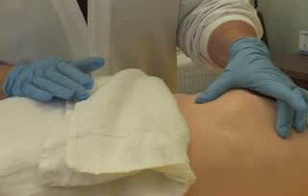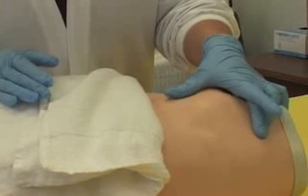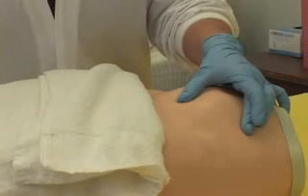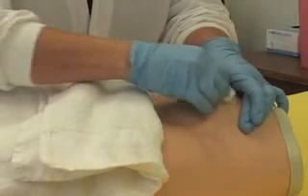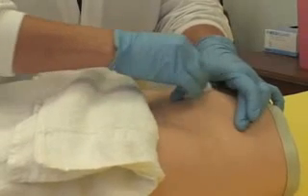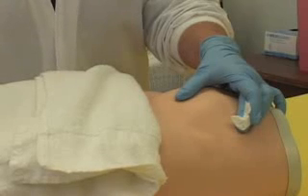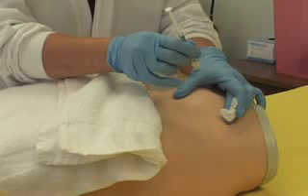Grasp and bunch enough tissue to allow an area of approximately 2 inches in diameter to be cleansed and to prevent accidental needle sticks to non-dominant hand. Cleanse the intended injection site thoroughly with alcohol wipe. Use a gauze pad in the lab, moving in a bullseye motion and working outward. Remove needle cap or sheath without contaminating needle. Do not allow the cap to fall into and remain in the client's bed.